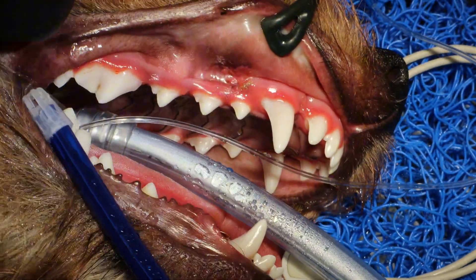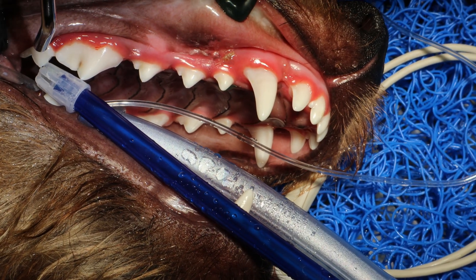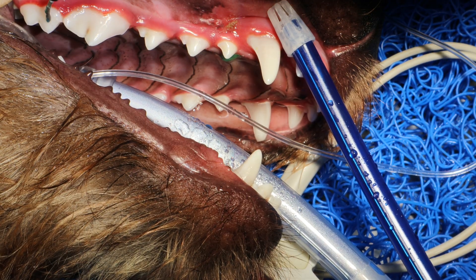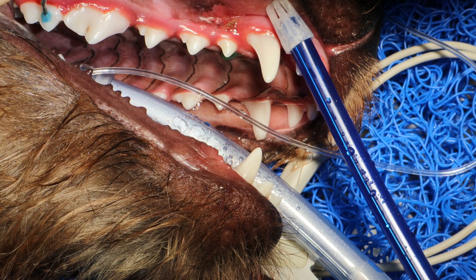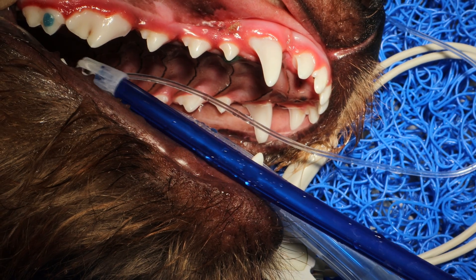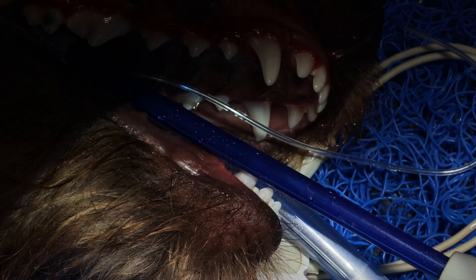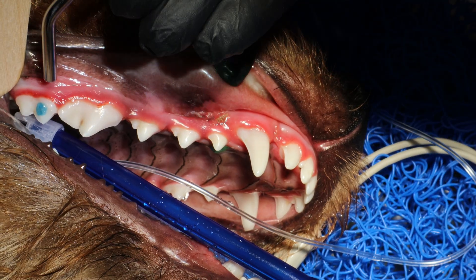Now we're going to dry the surface. You want to make sure that the surface is completely dry because when you're doing your bonding and acid etching, it needs to be dry in order to work. So apply the phosphoric acid here and let it stay for about 20 seconds. When you dry the tooth after, you will see that the area that was acid-etched has a kind of frosted appearance.